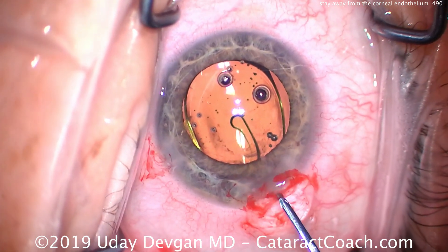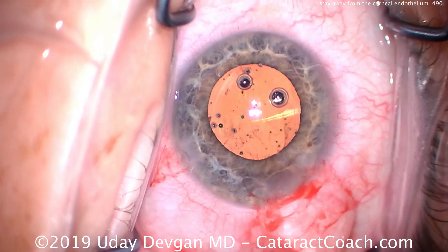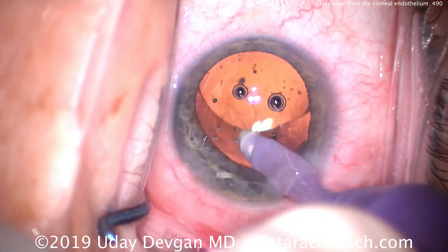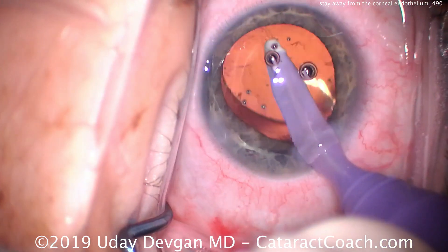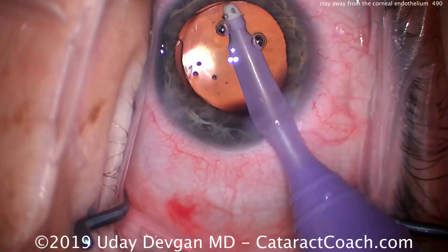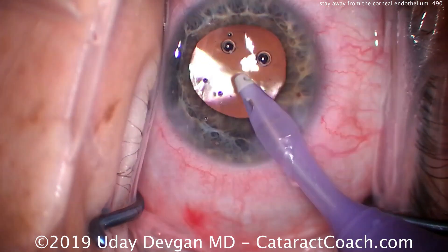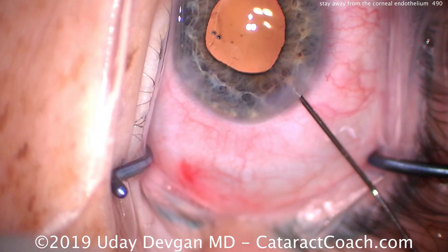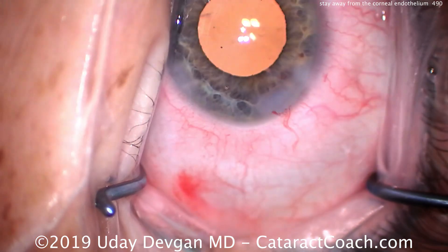Don't chase after these air bubbles, and don't chase after a little piece of lens material — it'll come out. We want that dispersive viscoelastic protecting the cornea during the phaco part. For I&A and removal of viscoelastic, of course we're going to take it all out, but for ultrasound energy, that dispersive viscoelastic is what protects the cornea and gives us the clear vision the next day. Next time you see an air bubble stuck in the dispersive viscoelastic against the corneal endothelium, leave it alone. If you do vacuum it away, go back in and put more viscoelastic. Remember: when we do cataract surgery, first do no harm. Don't damage the endothelium of the cornea — be very gentle and learn to be a little tolerant. You can look through these bubbles. At the end of the case, wash everything out — it looks great.